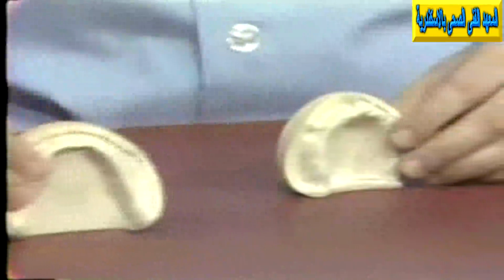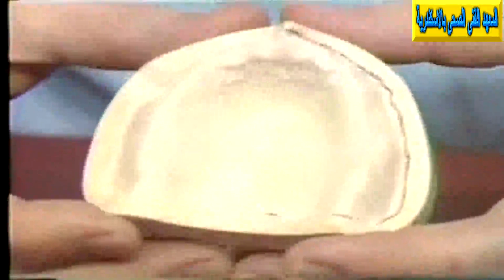The first requirement is that we preserve all of the tissue surfaces recorded in the impression and all the anatomical landmarks of the impression. And to do this, we want to end up with a landing, or what we call a boxing edge, of about 3 or 4 millimeters thickness all the way around the master cast.